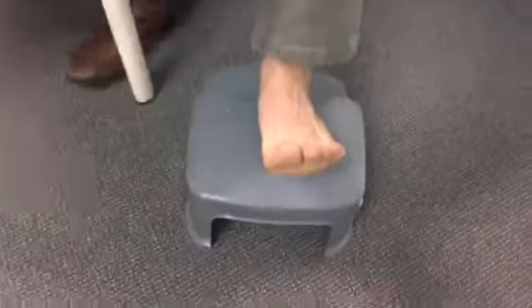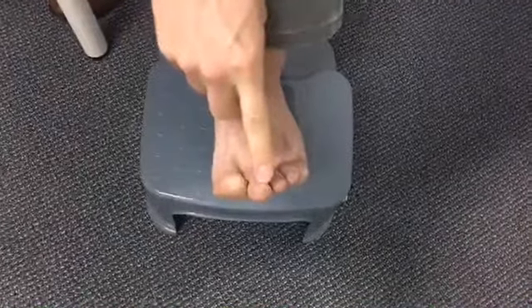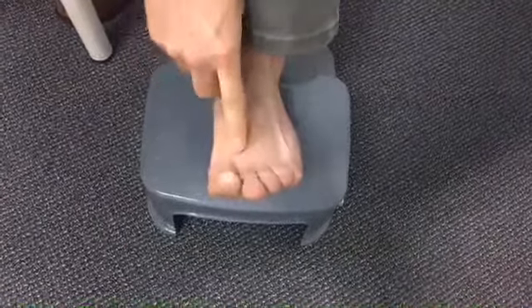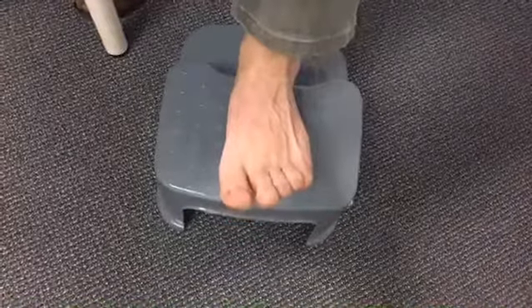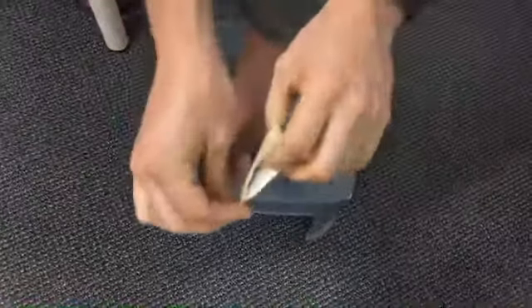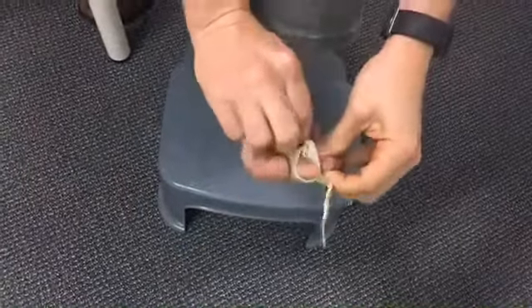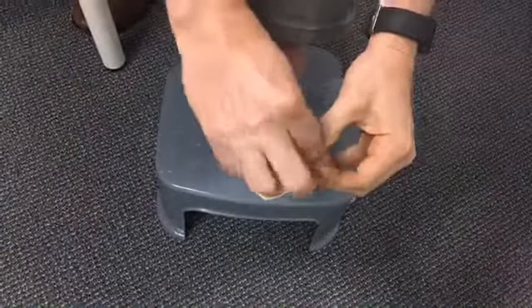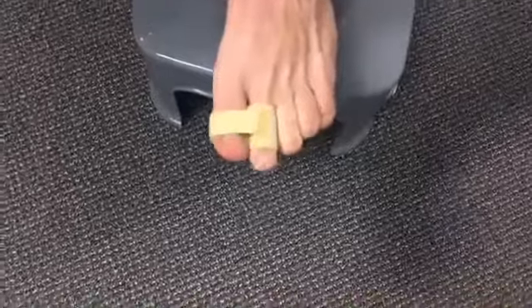Morton's toe is when your great toe is actually smaller than your second digit — it's not that the second digit is longer, it's that the great toe just didn't grow as long as it needs to be. As you can see, I have a pretty long second toe here. So let's pretend that's the injured toe or the one that's hammering. I take this wide toe loop, put it around the toes, and secure it with my great toe — just strap on right there. You can see there's a nice, effective support.